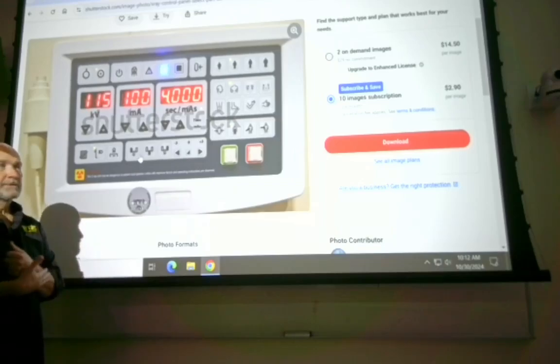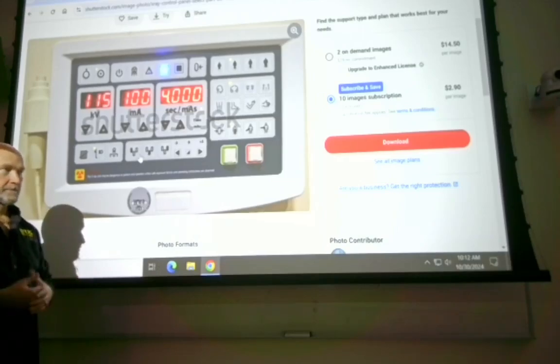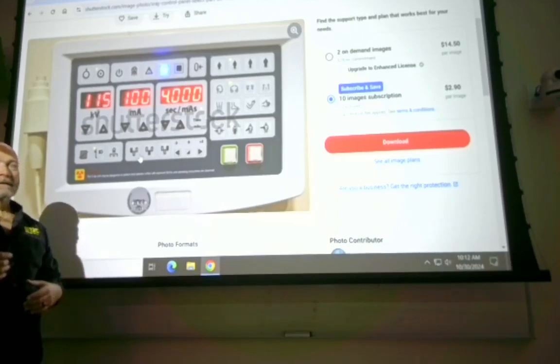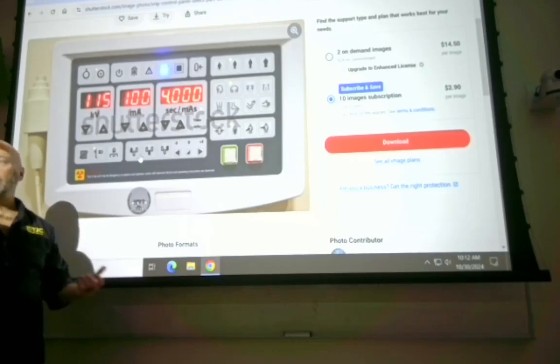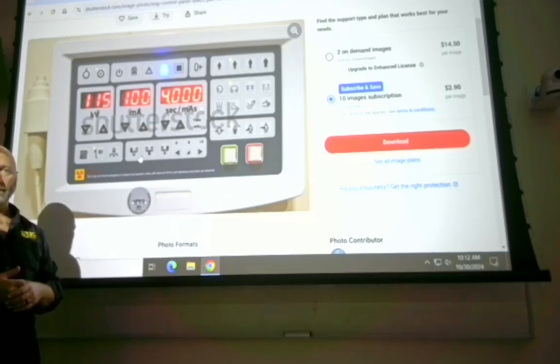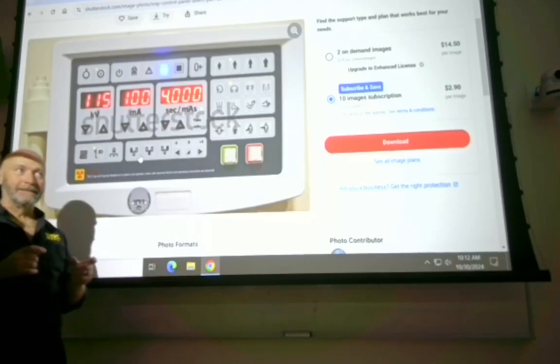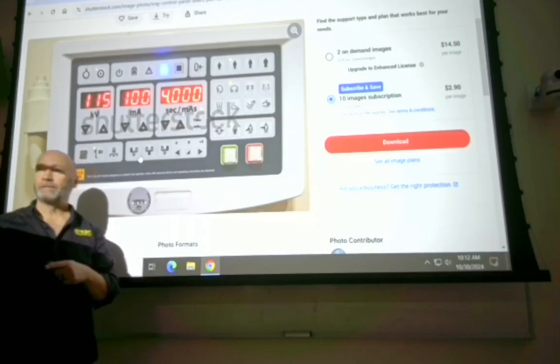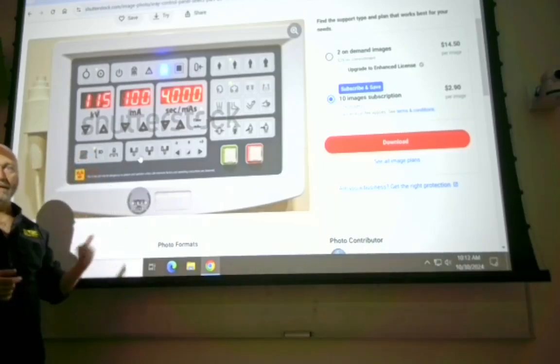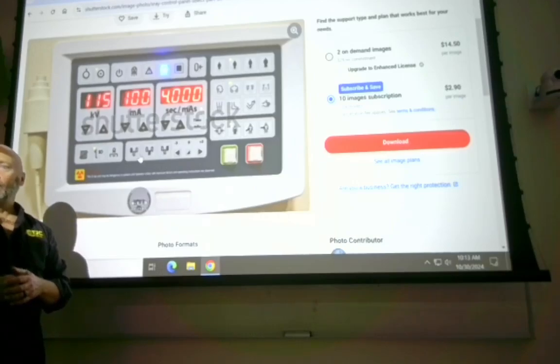So I worked in hospitals that took two totally different approaches to automatic exposure control. One is use AECs on everything that you can possibly use AECs on. Okay. So what do you think the most important thing is, and the thing that the department should stress accuracy in, in departments where they use AECs for everything? What do you need over the photocell?